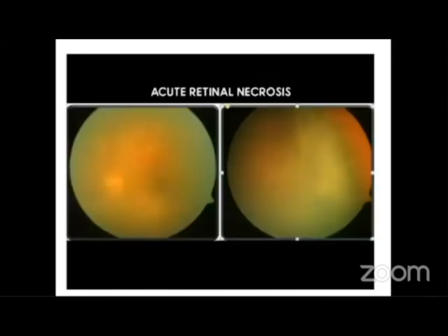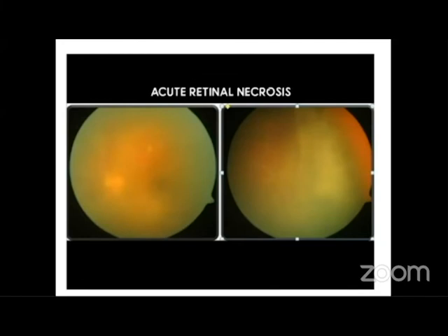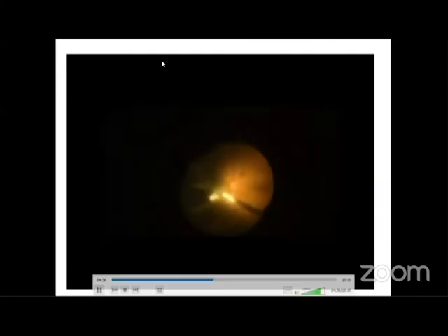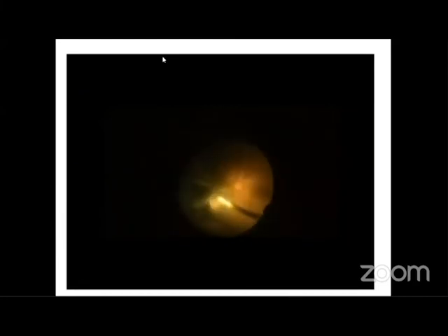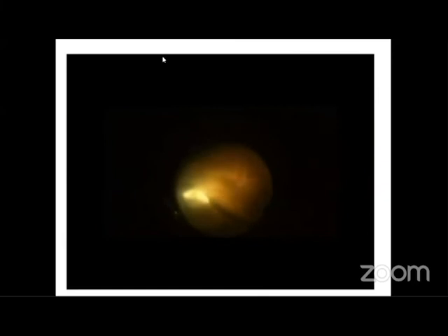Acute retinal necrosis is a devastating disease caused by varicella zoster virus, characterized by retinitis and occlusive vasculitis. Retinal detachment occurs in up to 2/3 of the cases. Chance of redetachment is high in ARN due to ongoing inflammation. Managing such cases is a challenge. Using wide-angle lens, core vitrectomy is done and dense vitreous membranes dissected, giving a clear view of the retina. Spontaneous PVD is common in ARN.